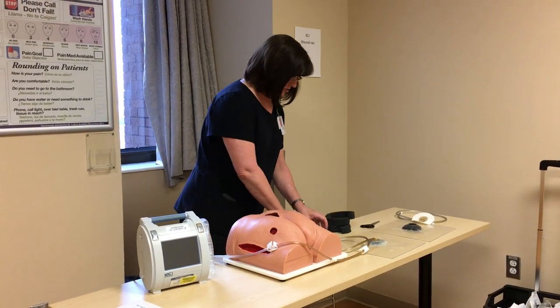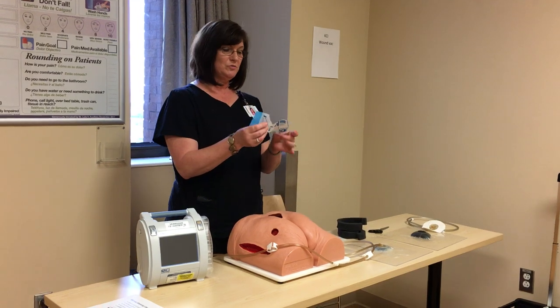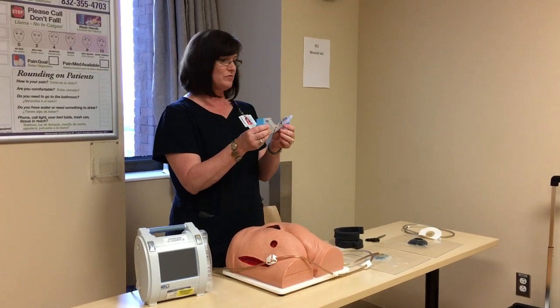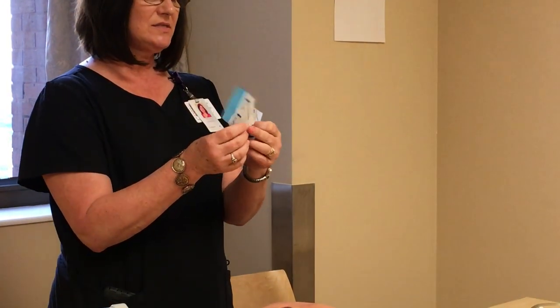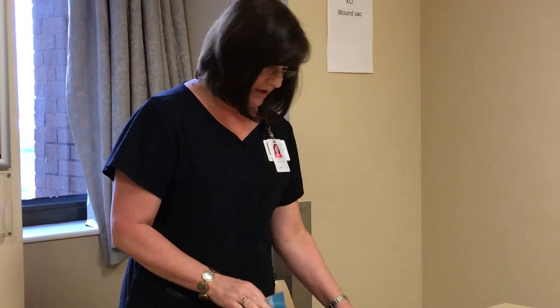With the VAC dressing, the drape is a simple one-two blue feature. If you've done VAC before, you know that. Side one is the sticky side — you take that off first. Side two is just a stiffener, just like on a Tegaderm, and then the blue tab comes off.